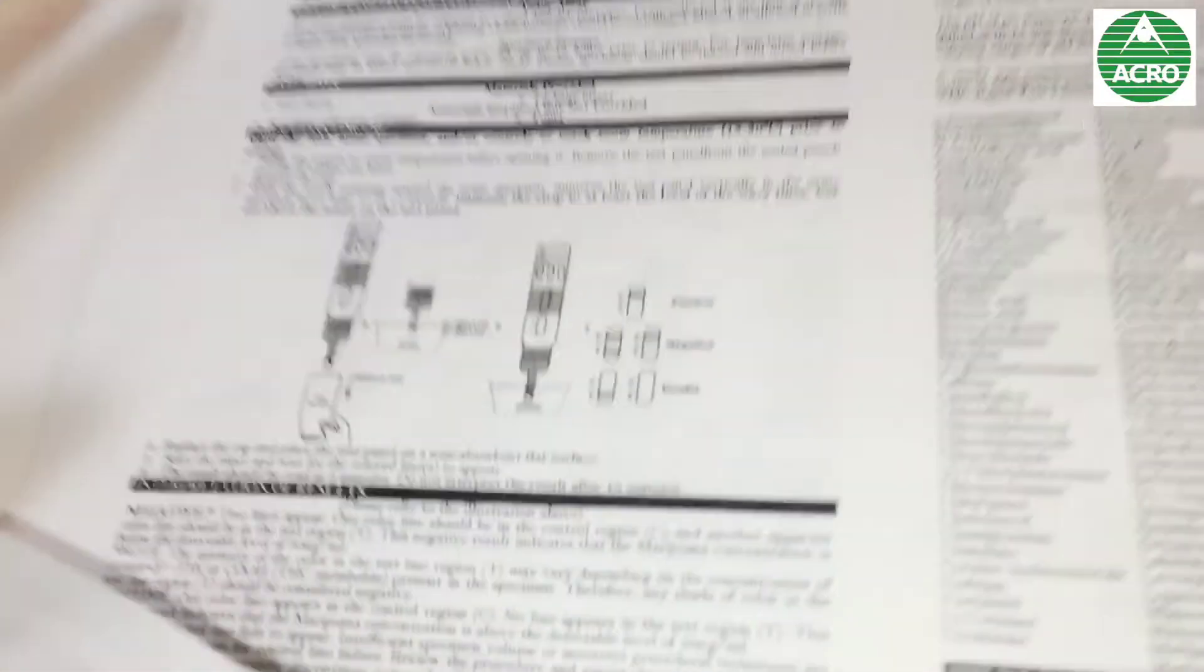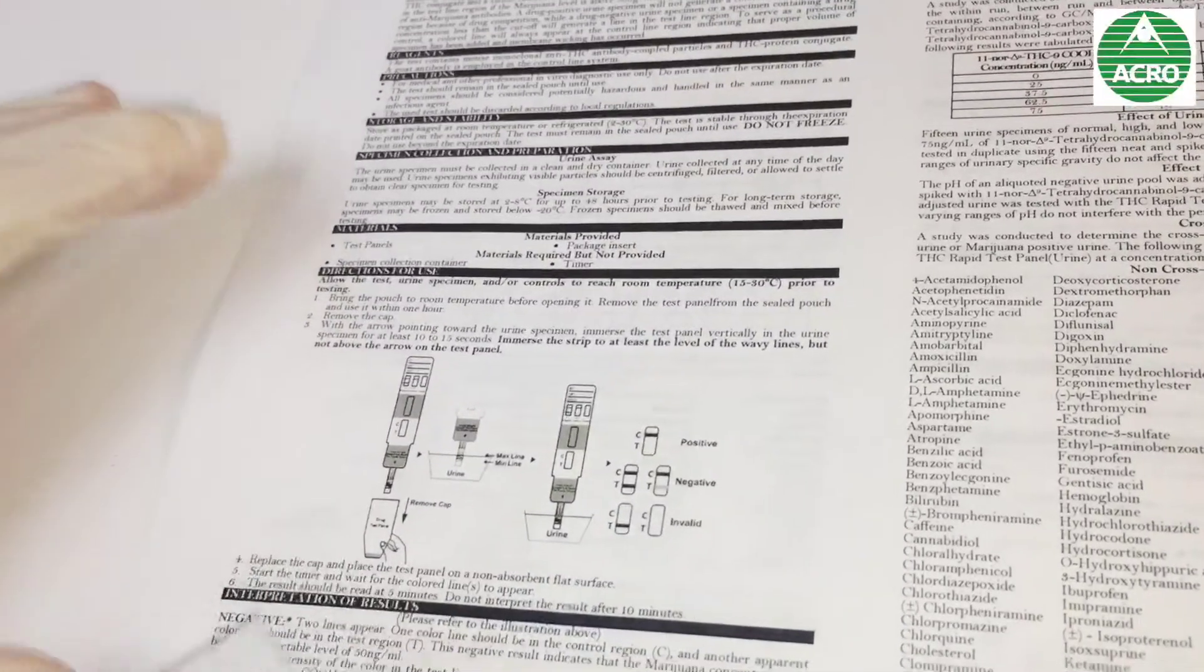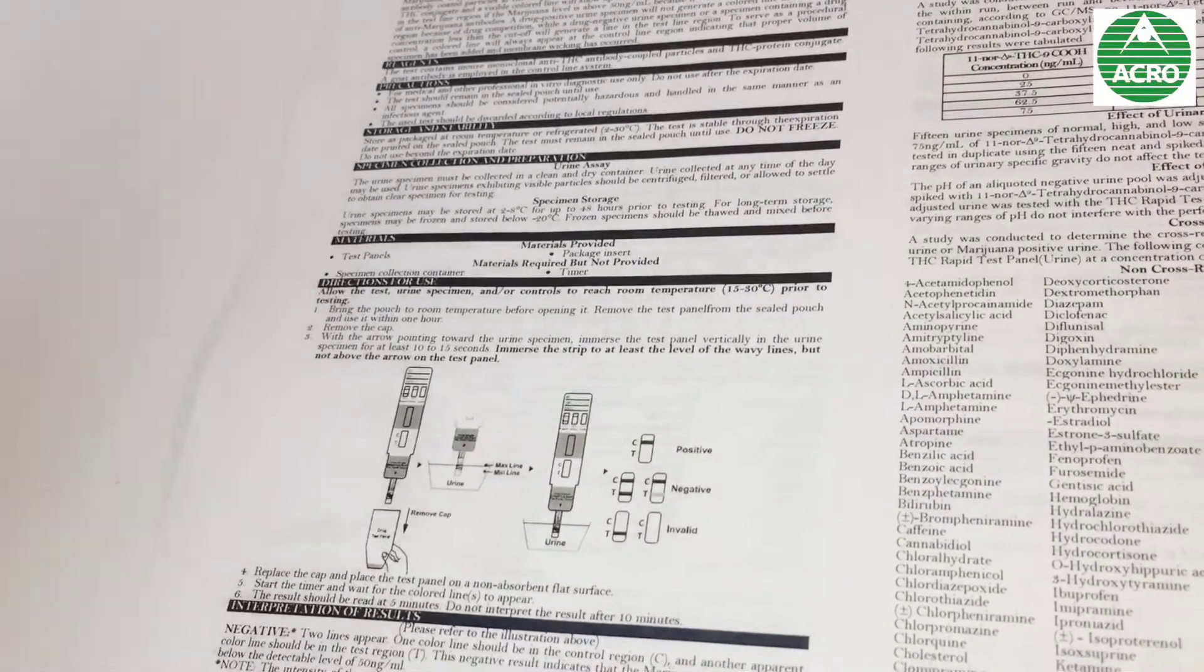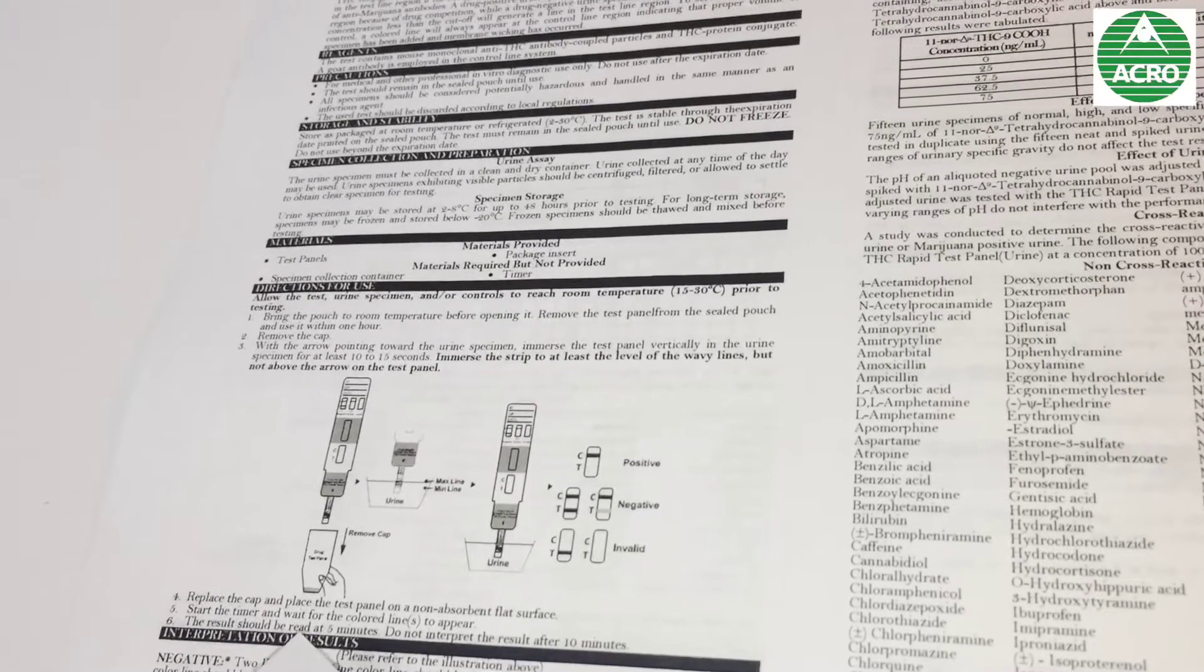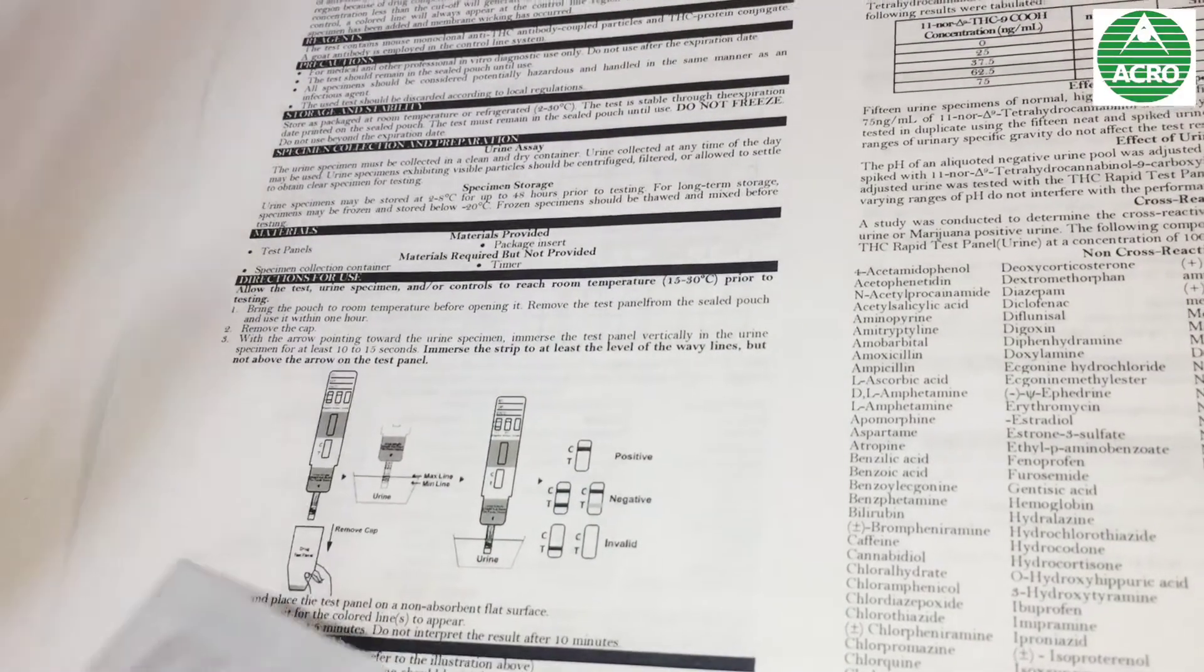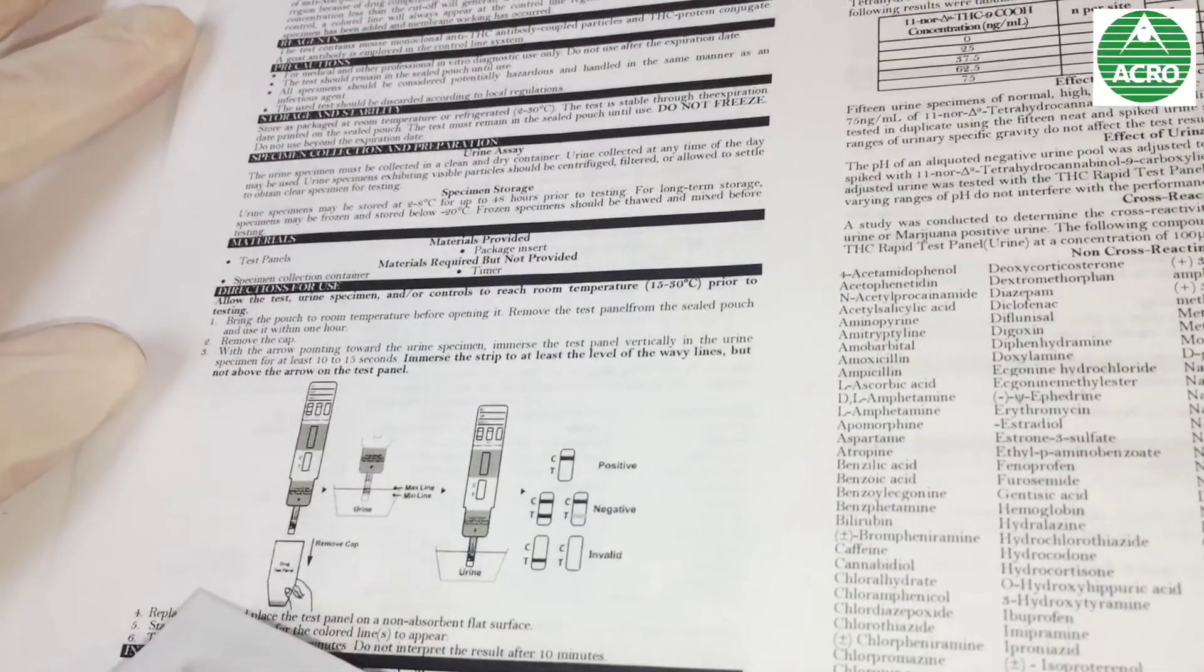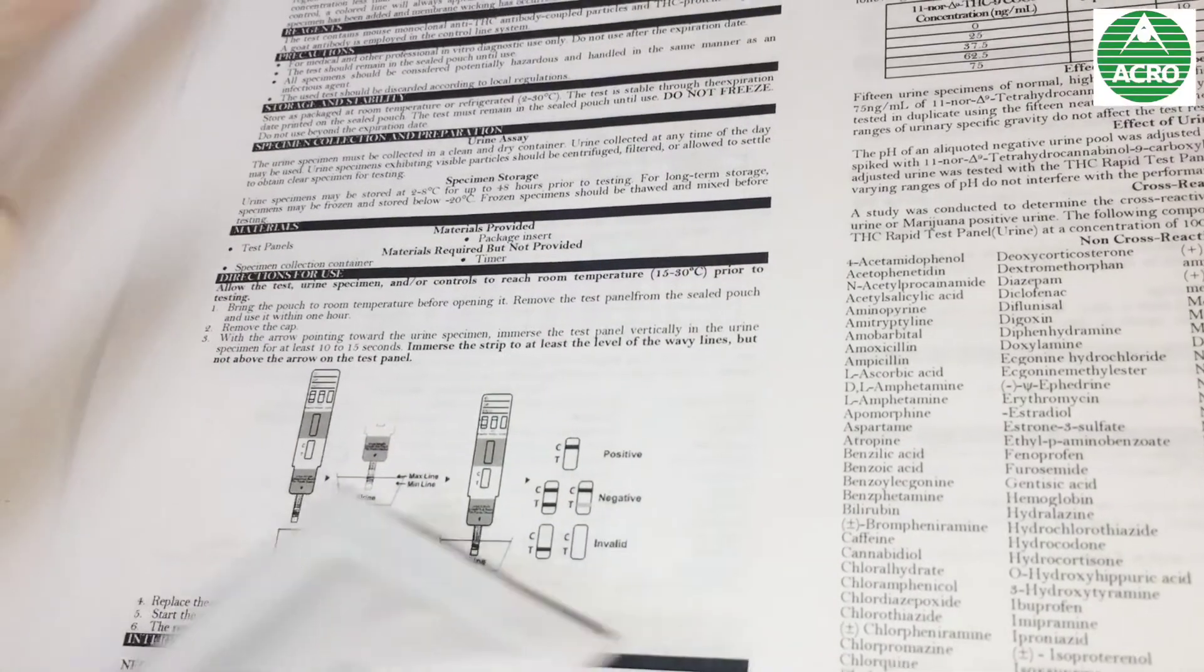First of all, let's review the directions for use. We have to open the panel and introduce the strip inside of the urine for like 10 to 15 seconds. After no more than five minutes, you have to read it. If you don't have the control line, that means you didn't do it properly. If you only have the control line, that means it's positive, and if you have both lines, control and testing line, that means it's negative.